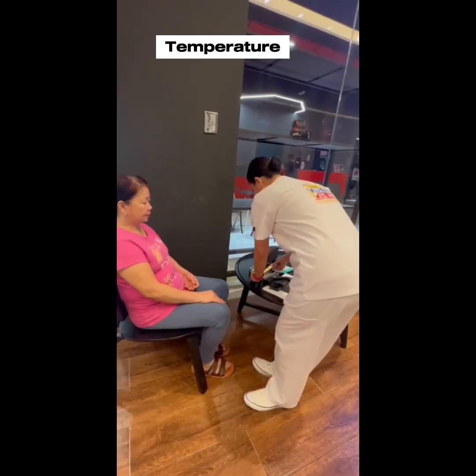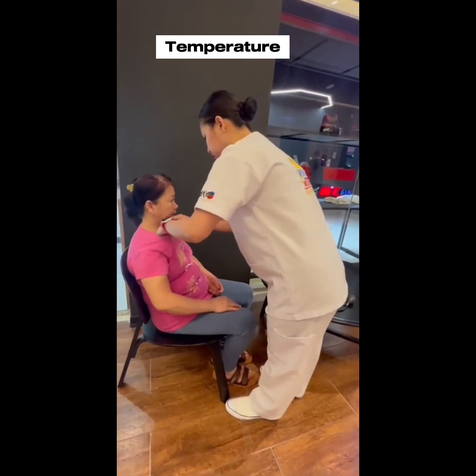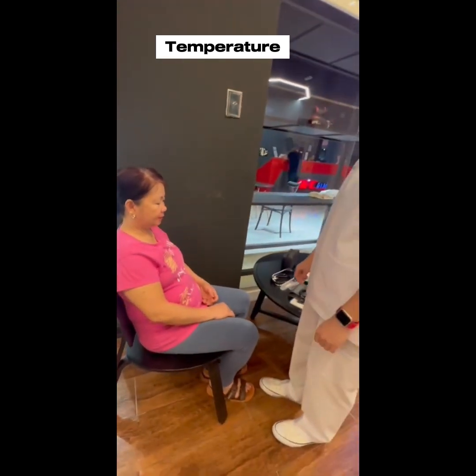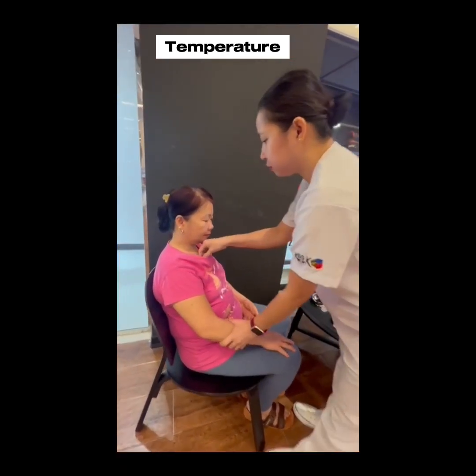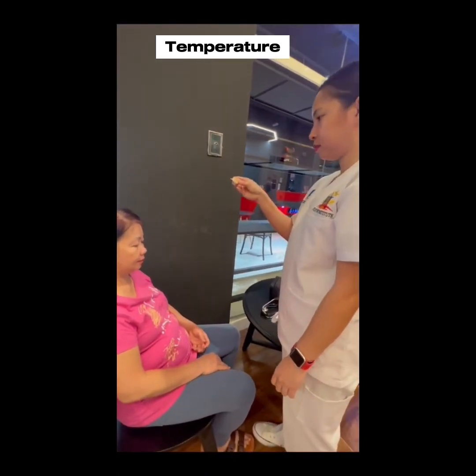For getting body temperature, help the patient assume a position of comfort. Axillary temperature: this is to promote relaxation. Take the thermometer, turn it on, and place it into the armpit. Placing the device in contact with the axillary blood supply can maintain the device in the proper position.